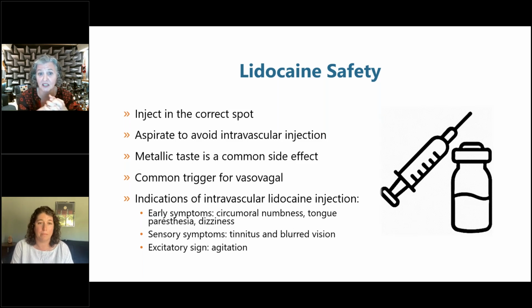That might be signs that there's some amount of lidocaine that's been absorbed and they're starting to have more of a systemic reaction. Now, realize that just doing a block, just all by itself, can trigger vasovagal. But you've already given the person anticipatory guidance, so we're not concerned. They can handle it.